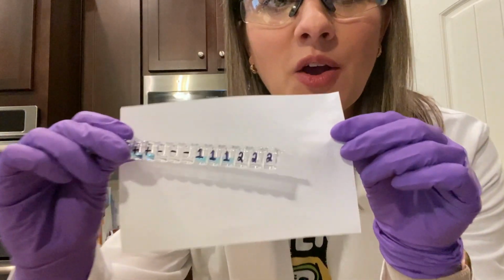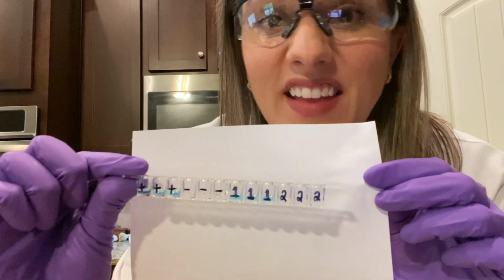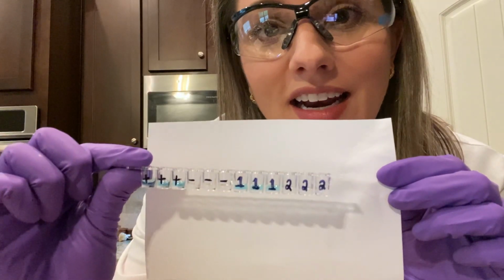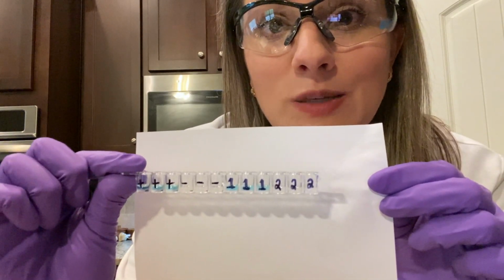So what can we conclude from our results? Well, if we take a look at our container, we can see that our positive wells are nice and bright and blue, meaning yes, antibodies are present. And that's good because that's our positive control, so it should have turned blue. Our negative control stayed clear, meaning there are no antibodies present, which again is good because that's our negative control and that's what we expected.